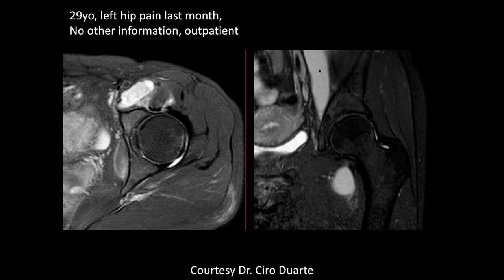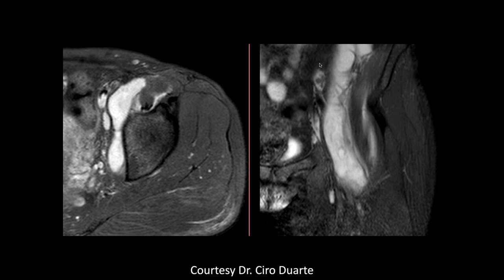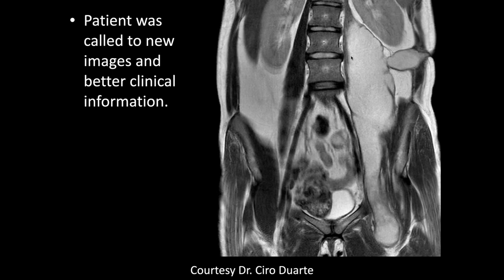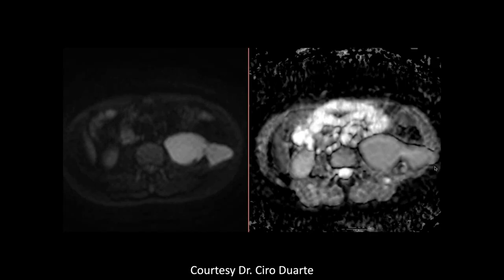An iliopsoas abscess is seen with diffuse surrounding edema and rim enhancement on post-contrast images. It's very extensive throughout the entire left iliopsoas muscle, with a tract extending to the left lateral abdomen — possibly the initial site of introduction. Diffusion restriction and rim enhancement are present. The patient had prior TB surgery and is HIV positive.